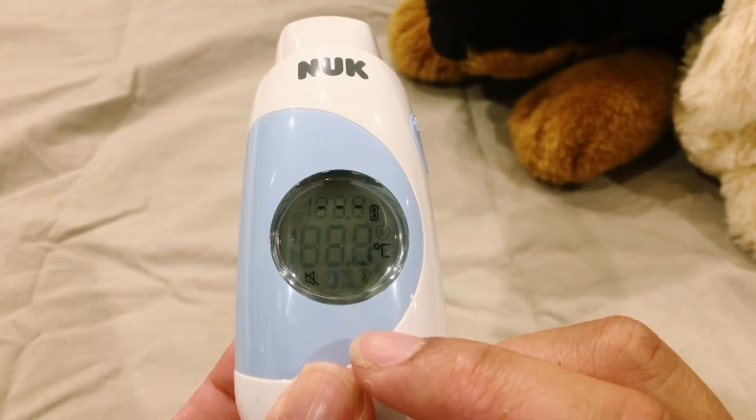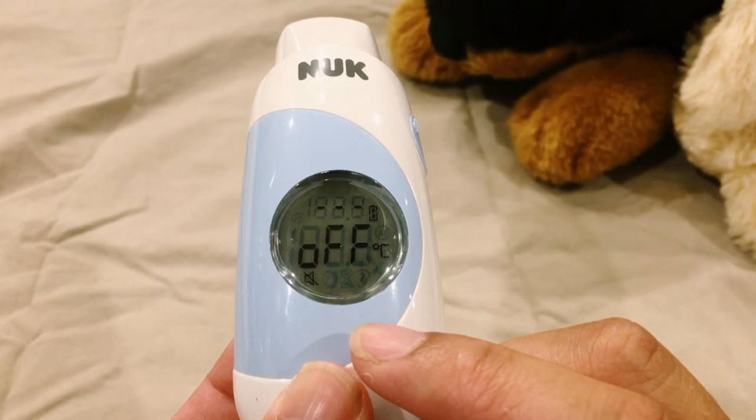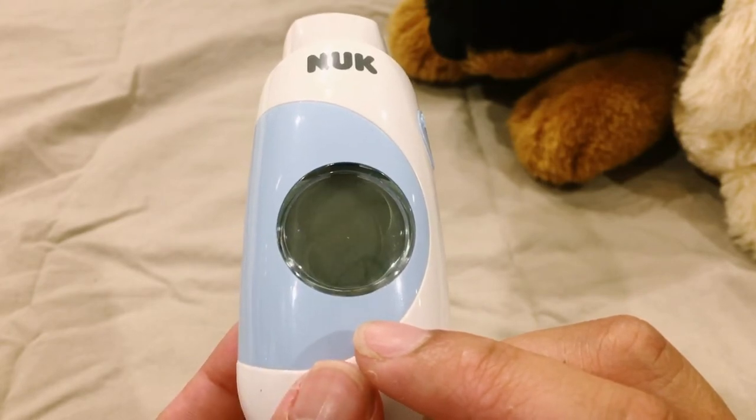Lastly, to switch off the thermometer, hold the on and off button until the off symbol appears on the display.